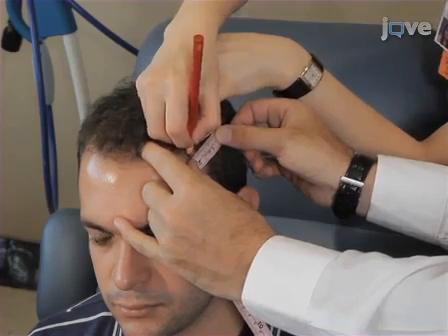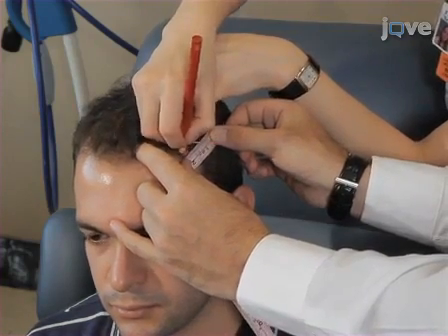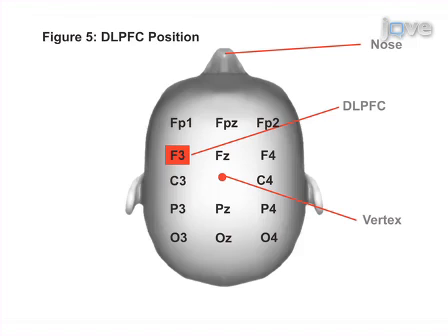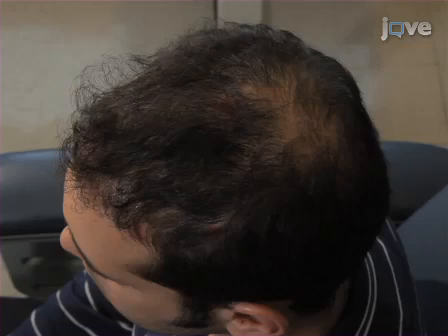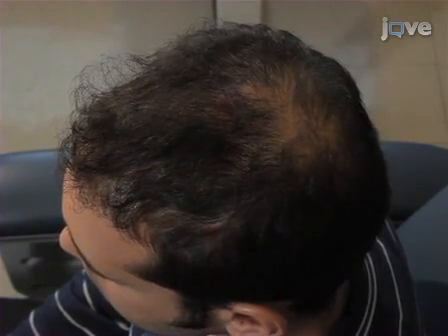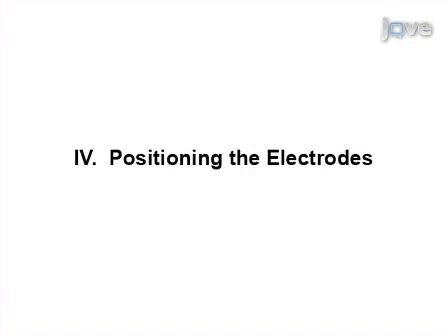To locate the dorsolateral prefrontal cortex, measure 5 cm forward from the M1 location. This should correspond to the F3 or F4 EEG location, as seen here. This method of determining the stimulation site is sufficient when using traditional TDCS electrodes. For more focal TDCS, other methods of cortical localization may be needed, such as neuronavigation.